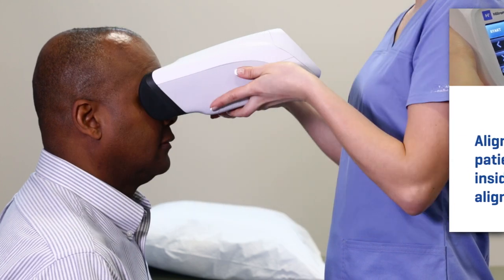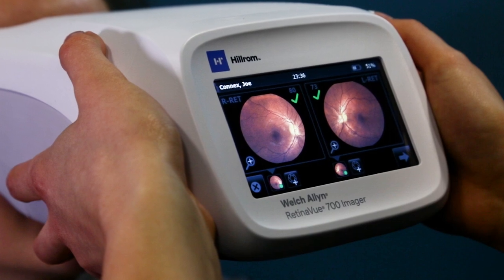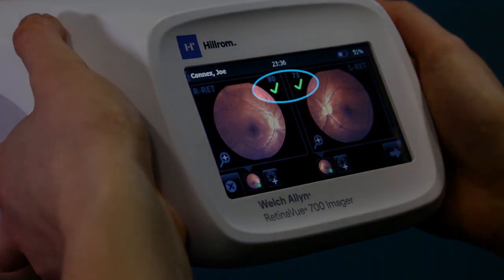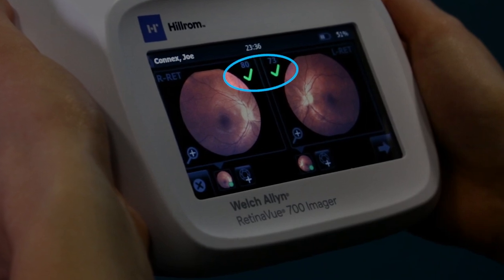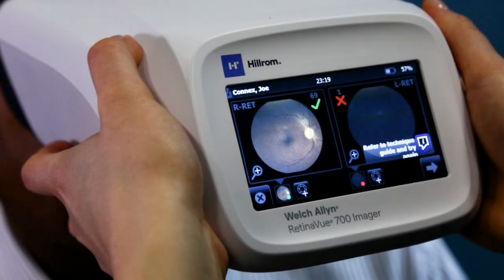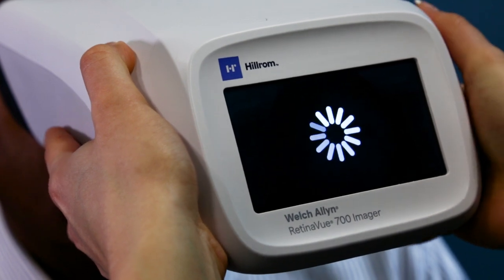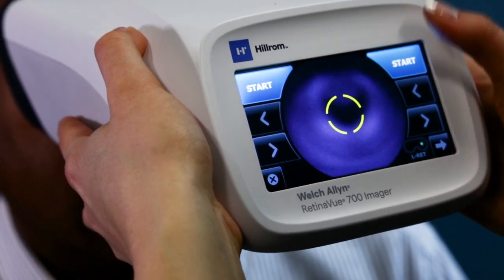Once both images have been captured, the acquired images will be displayed on the post-acquisition screen. For each image, there is a quality assessment. The quality assessment indicates the likelihood that the image is interpretable by an eye care professional. It is possible to take a second image by clicking on the plus image icon on the screen. That will bring you to the start screen to repeat the image acquisition sequence.